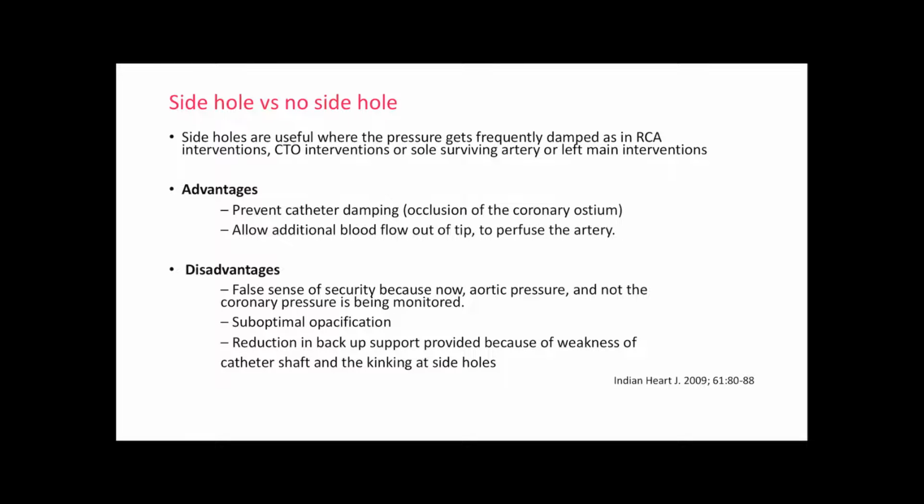Now there are catheters which have end holes, just a hole through which the contrast or the guide wire comes out. So the main lumen hole communicates with the main lumen in the direction of the catheter. But there are side holes around.